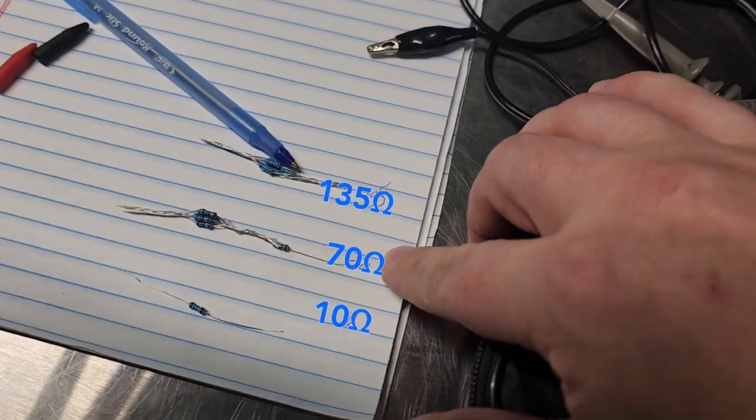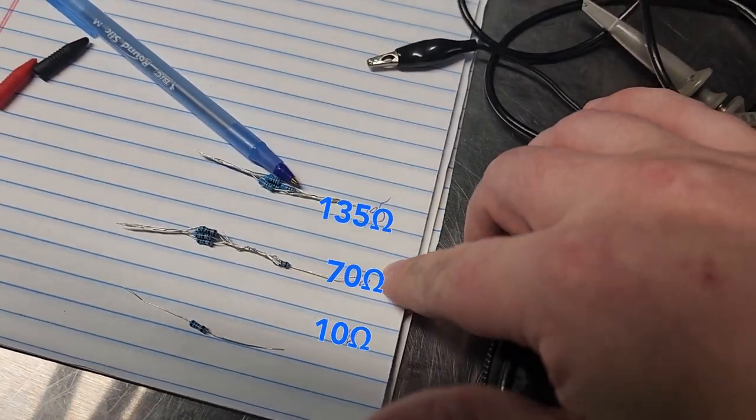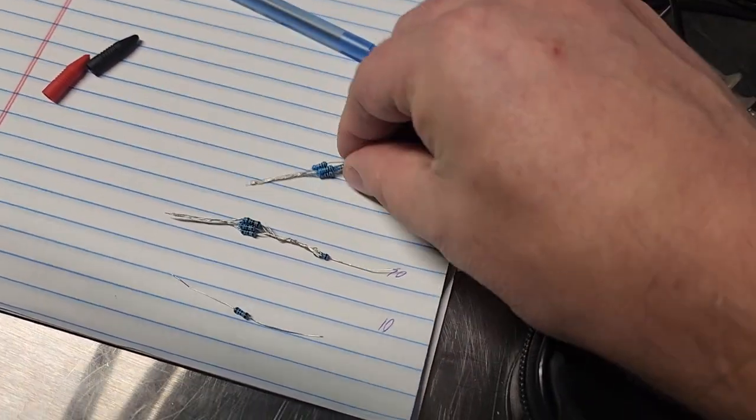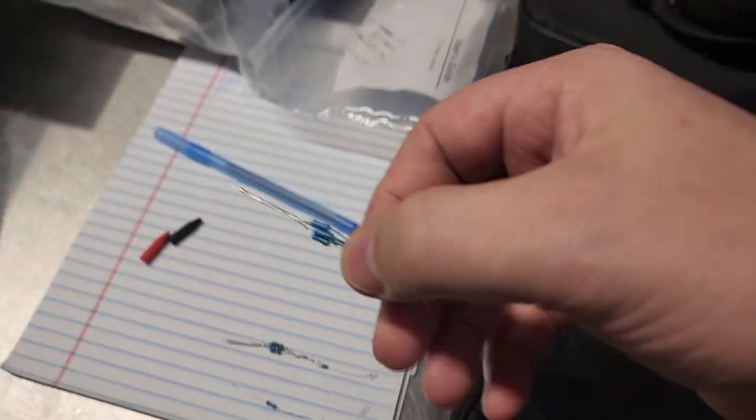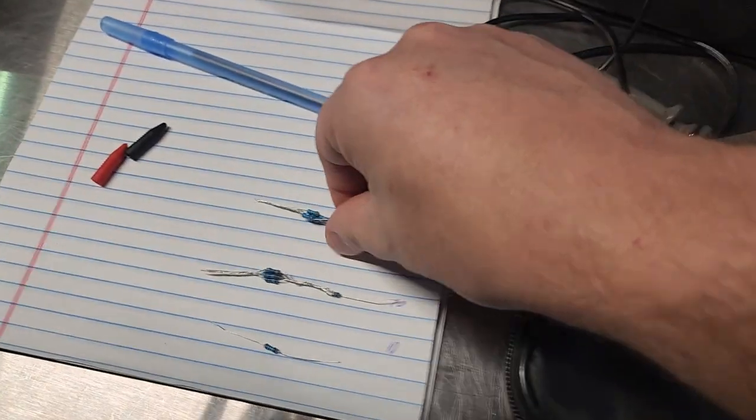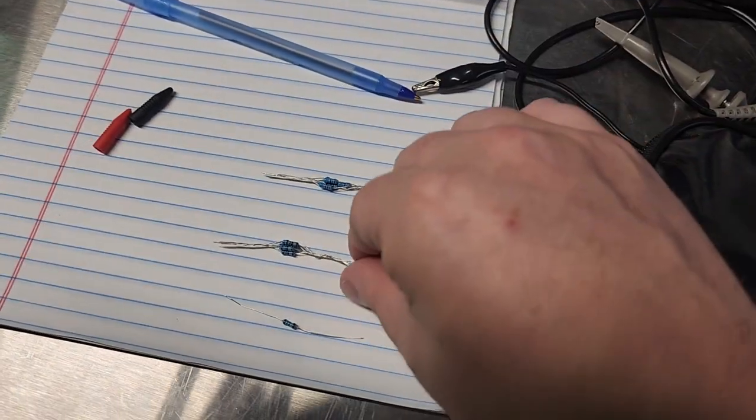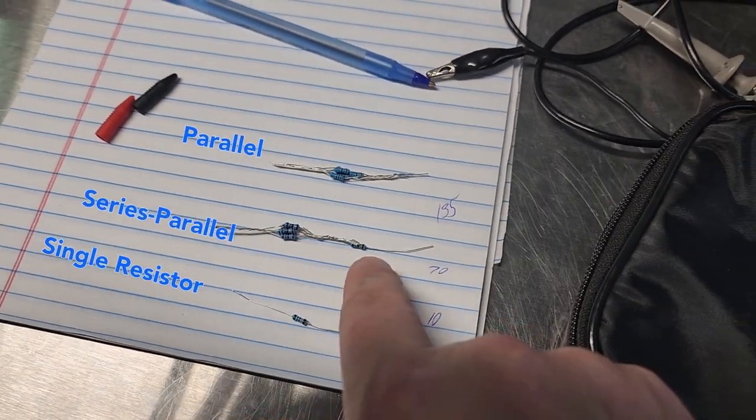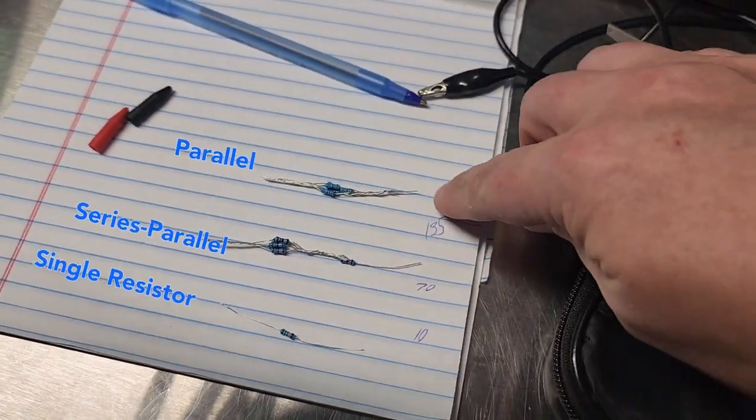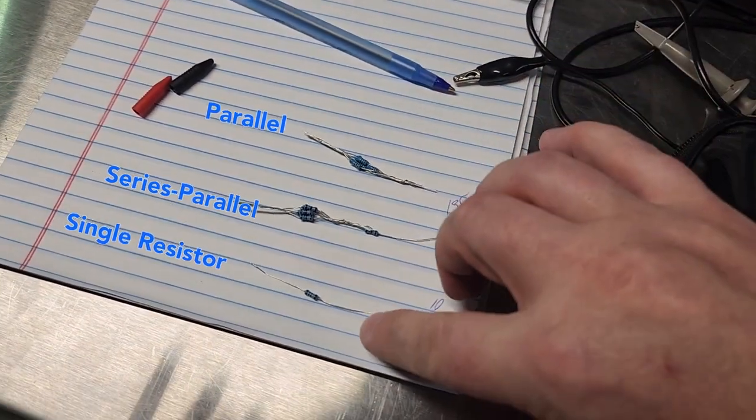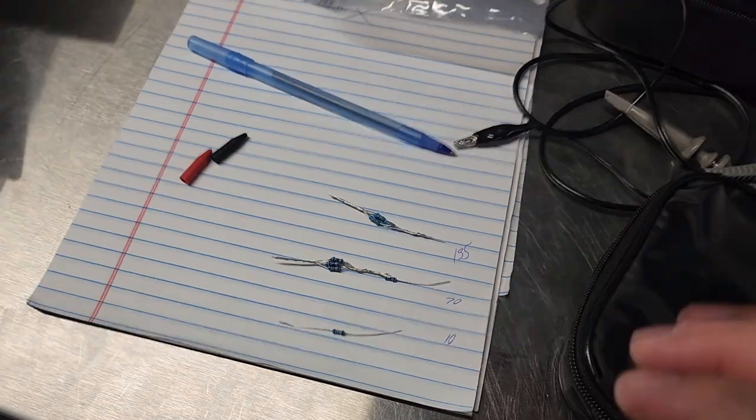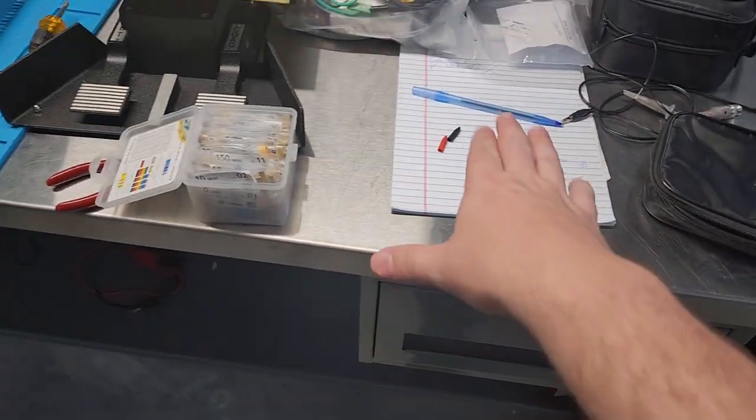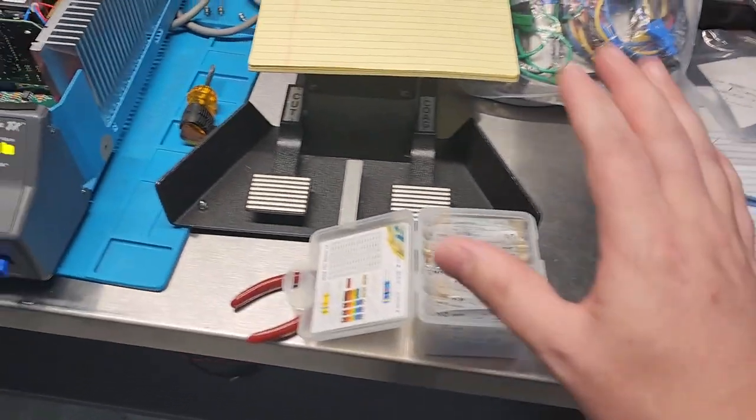Here's a 10 ohm, here's a 70 ohm, and here's 135 ohm. And you're probably looking at these like holy cow. That's right, guys, back to electronics basics. You got a series parallel configuration, you have a parallel configuration, you have a single resistor here. That's how you get those.